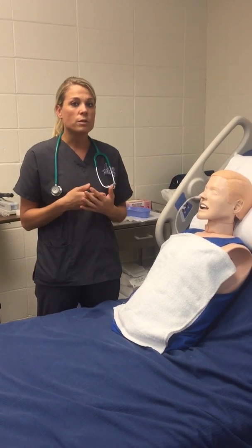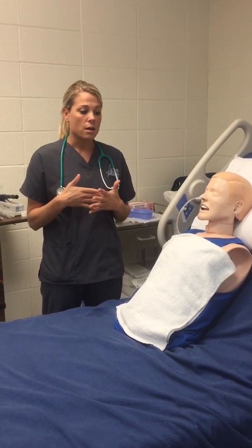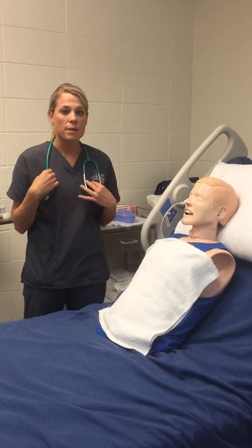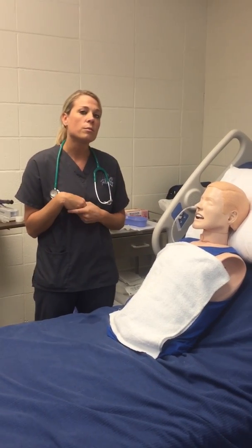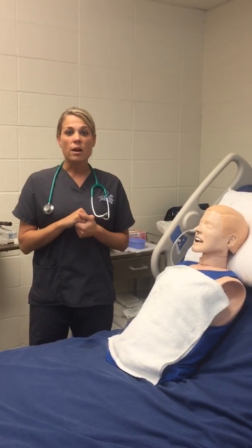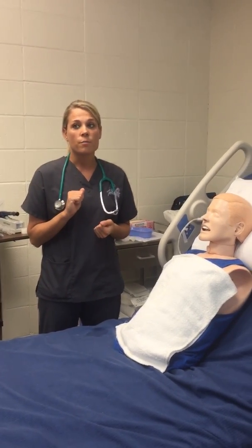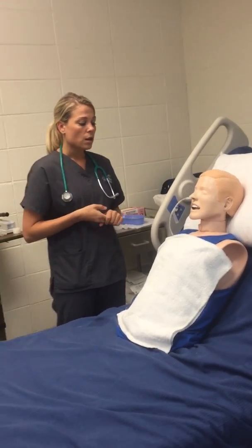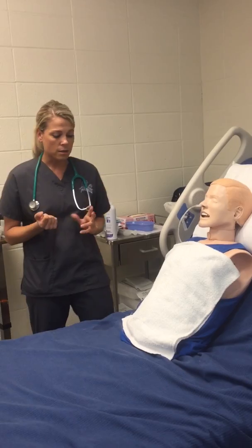So the first thing I would do is assess my patient by assessing all 4 quadrants of his abdomen, listening for his bowel sounds, making sure they are normal. If he is on continuous tube feeding, I would stop that and wait 30 minutes before removing the NG tube. So all of that has been done.